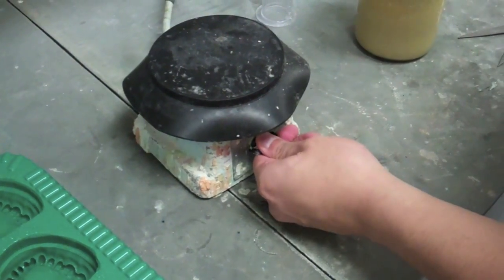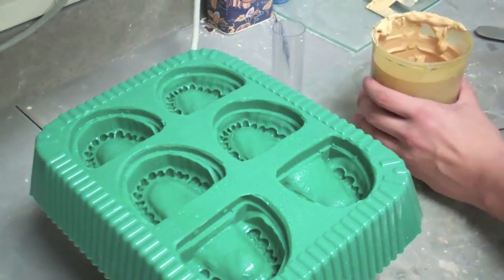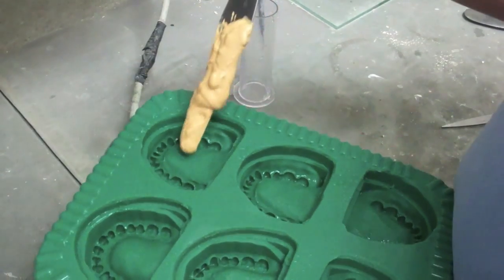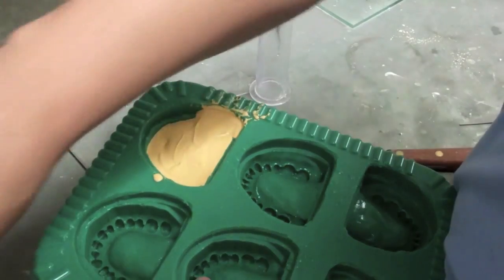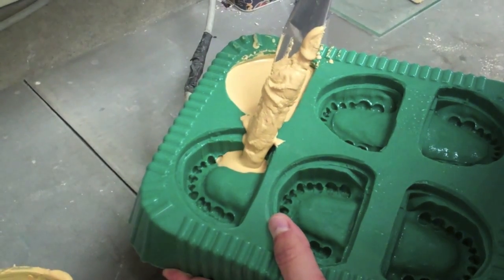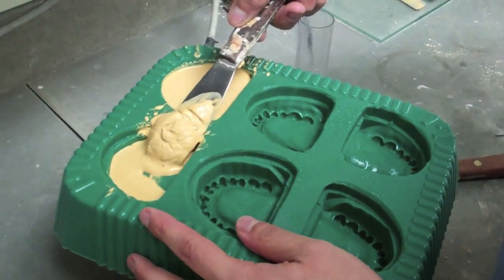Now that the stone is mixed, you can turn on the vibrator and place the molds on top. Using a spatula, take some stone and flow it into the mold. A helpful tip would be to do this slowly and flow the stone from one side to the other, watching the stone flow through every crevice. This will ensure that no bubbles will appear on the occlusal surfaces.